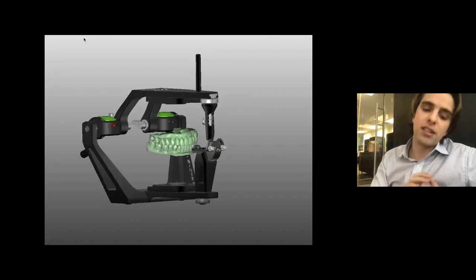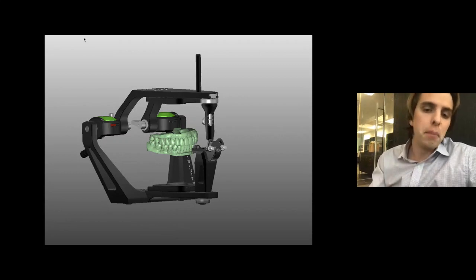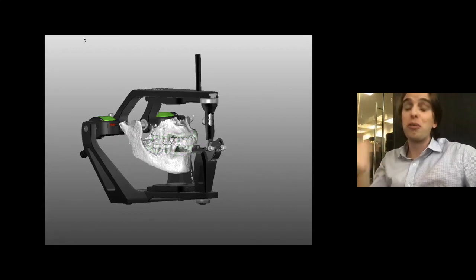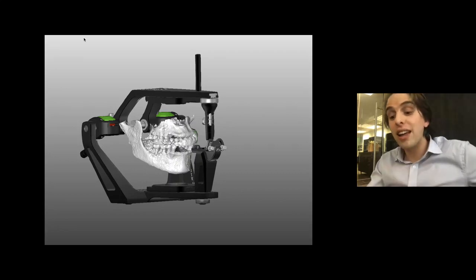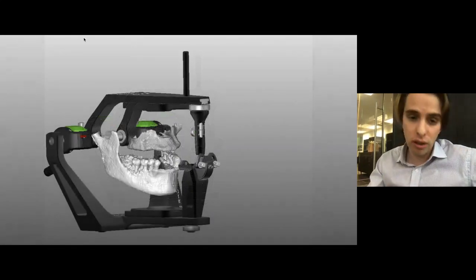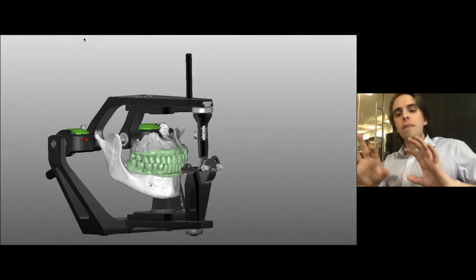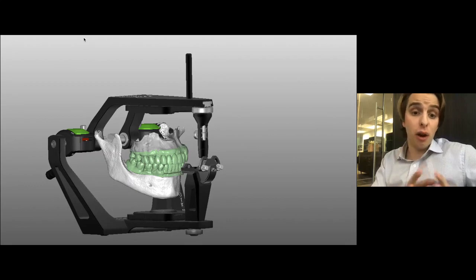I will say this is a different patient, but just follow the logic here. And we can then merge the CT scans to that mount, and we can use some of those principles I showed you in the first cases, where we can cut scans and perform a virtual tooth extraction to our needs and necessities without losing sight of the references that we need from the pre-op scan.